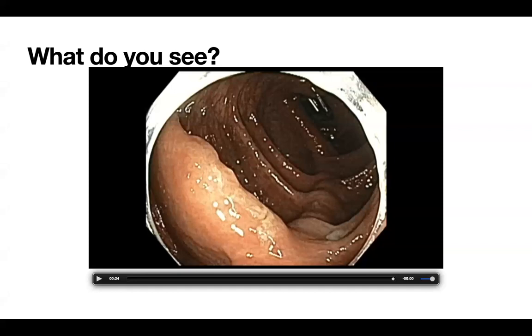From a patient's point of view, there is an advantage. The patient is going, and for the referring physician, the advantage is they're starting from scratch, as if somebody has had complete clearance of all the polyps. From an endoscopist's point of view, say for example if you have a large EMR practice, these patients are going to take your next 2 slots that could be used for an EMR of another patient.